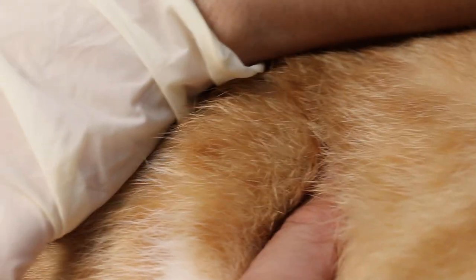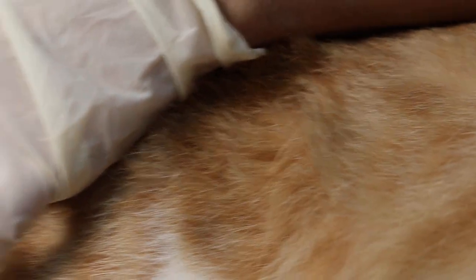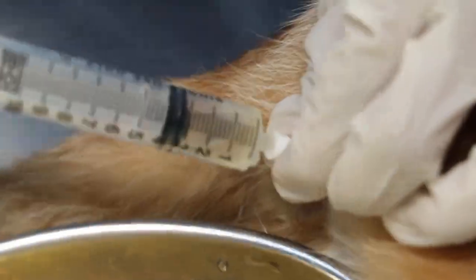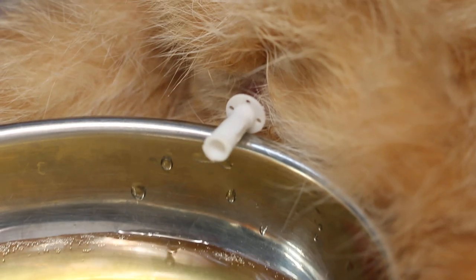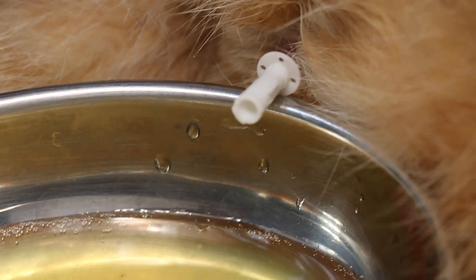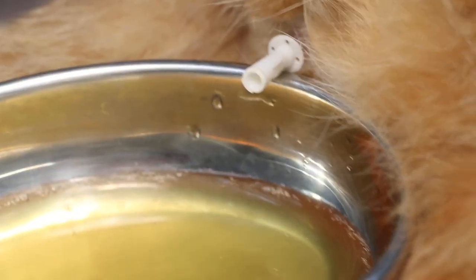Now you can see the bladder, it's a small bladder here because we irrigate through the catheter, of course. You cannot do without the catheter. This is a very common condition in cats. So it's likely to be FLUTD, where there is no infection and blood, or FUS they call it, due to stress.